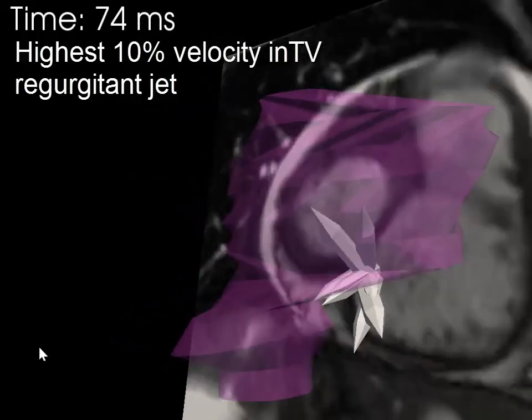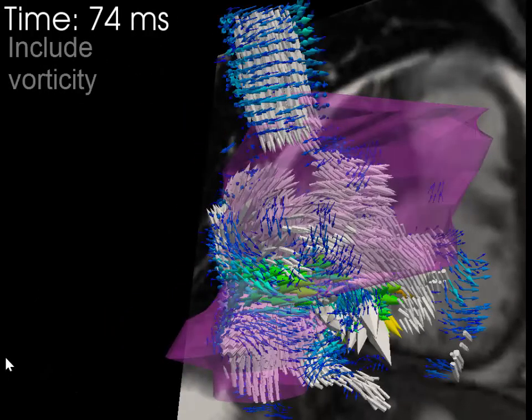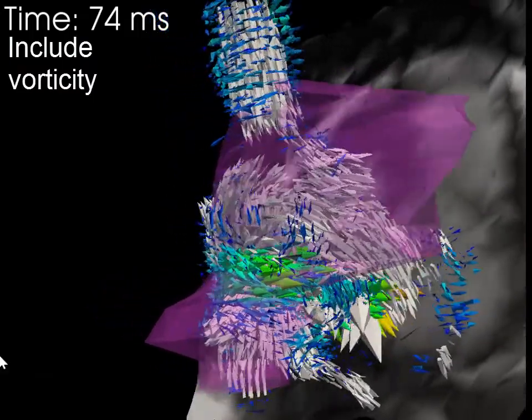However, this patient has a significant tricuspid valve regurgitant jet which increases mixing in the atrium.